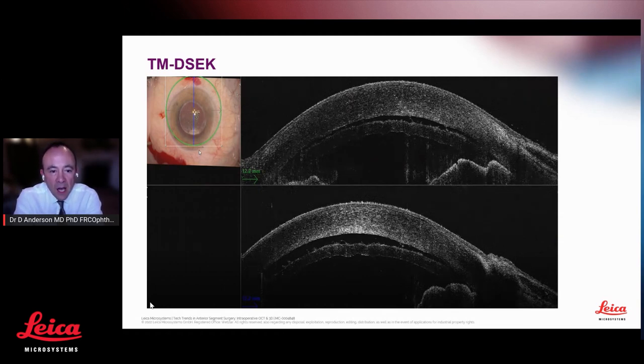If we look at the upper surface of the donor lenticule, and you might see that in both of those pictures, you can see this kind of ruffled superior edge, these stromal fibers visible, and we like to call that a sunspot sign because they look like little sunspots coming off the sun.